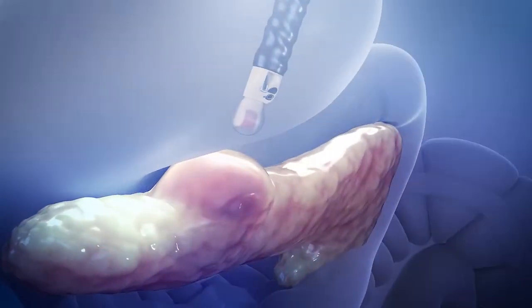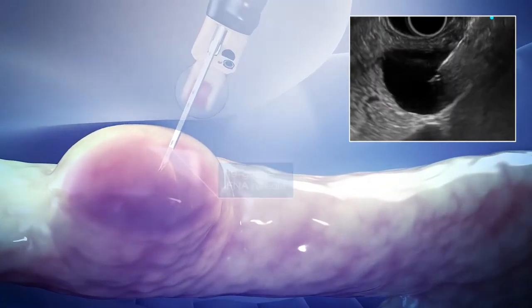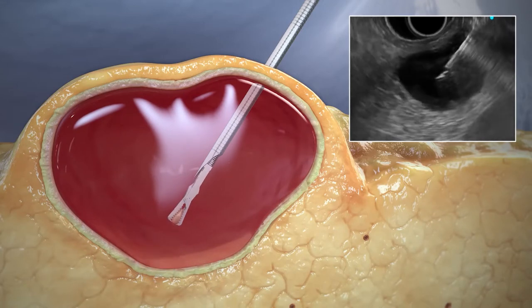The Moray device is small enough to fit through most 19-gauge FNA needles, yet its serrated jaws open to 4.3 mm, allowing for tissue recruitment and sampling.